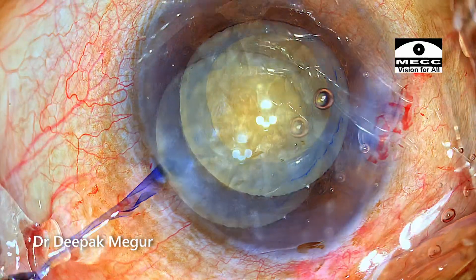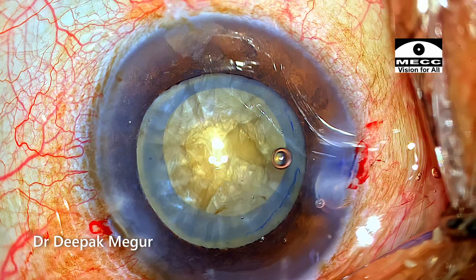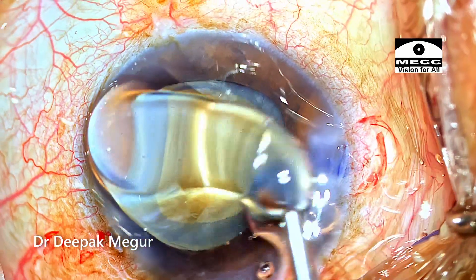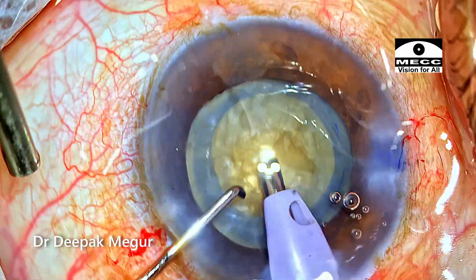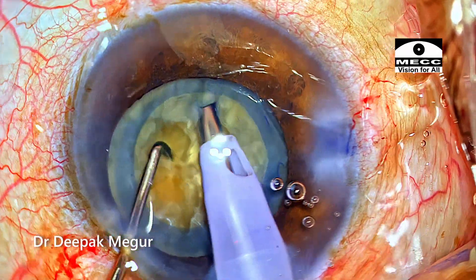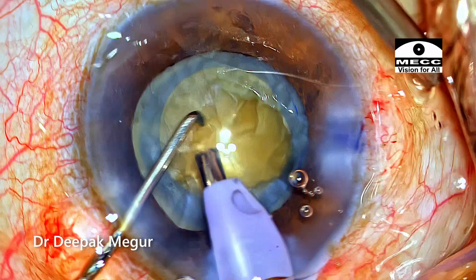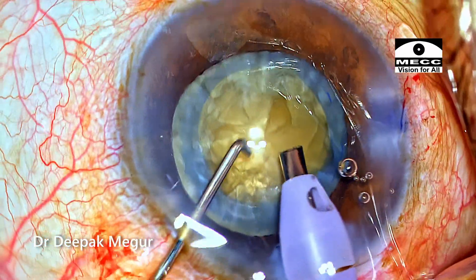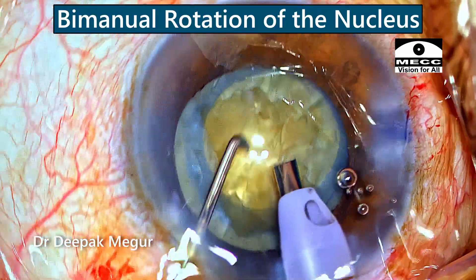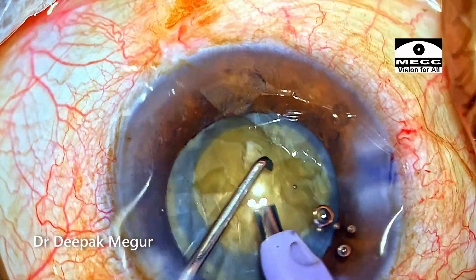I do have a rhexis, but it is not the most ideal size — still on the smaller side, though sufficient to manage the nucleus. The next challenge is dealing with this hard nucleus. I am also expecting the zonules to be slightly compromised due to pseudo-exfoliation. Hydroddissection is avoided in such cases with intumescent cataracts. The phacoemulsification probe is introduced, and after aspirating the superficial nucleus, I rotate the nucleus using both instruments bimanually to put less stress on the bag and zonules.